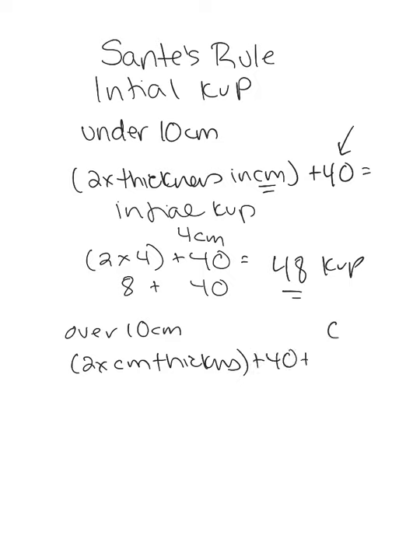And then we have to add something called the grid factor. That grid factor is given to you by your manufacturer. It's going to be different for each machine. The ones we have at MATC are 8, so you can just memorize that number for MATC. What a grid is, is something we're going to talk about in another few weeks. For now, I just want you to accept that it exists, and I'll explain it more when we get there.